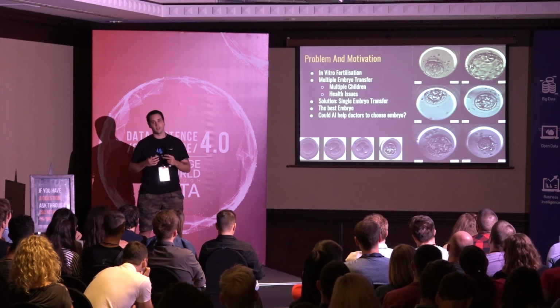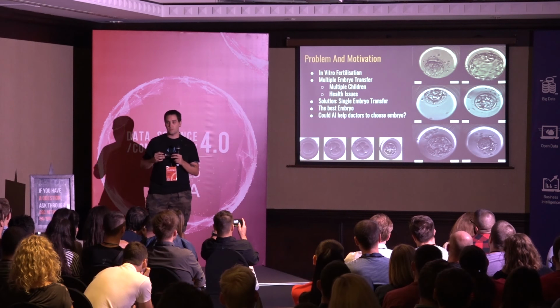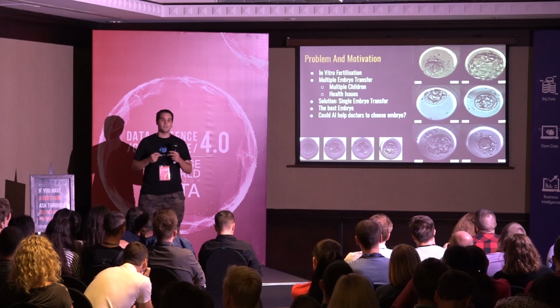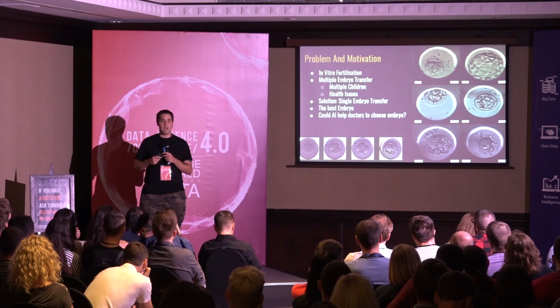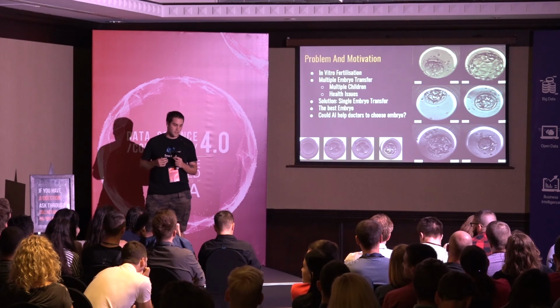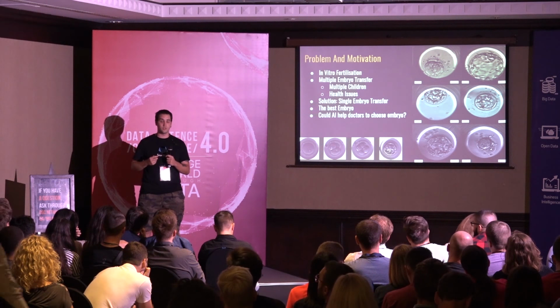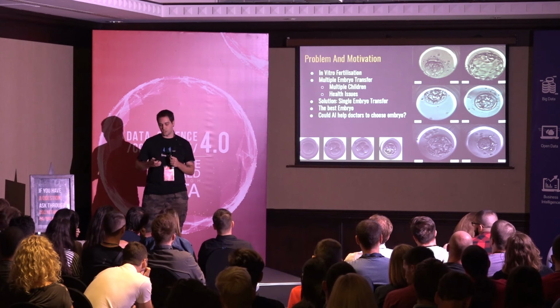So doctors look at the pictures or videos of the early stage embryo developing from the first day until the first 5 days, and then they use some metrics like the shape of the embryo, dimensions, the time when the embryo cells divided, etc., etc. And with labeled data, with labeled videos, we can train some machine learning algorithm that could help doctors, not to replace them, but to help doctors give the final decision.